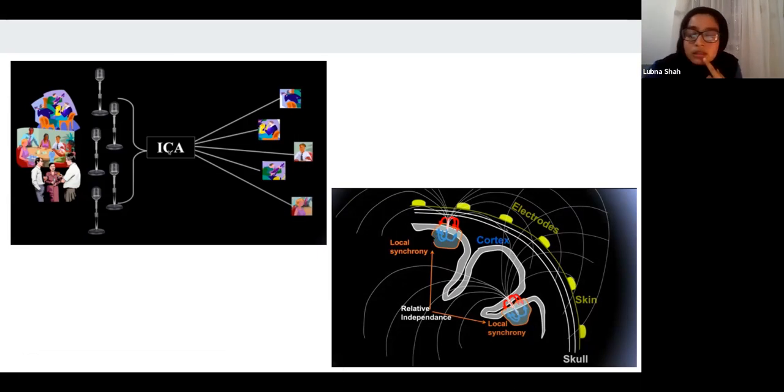So these signals are going to be picked up by all the electrodes at some level. This electrode will get the most of maybe this signal, but by these waves you can see that these two electrodes are picking up this signal, but then this signal is also being sent from this electrode to all of these electrodes. And that's really difficult to measure.